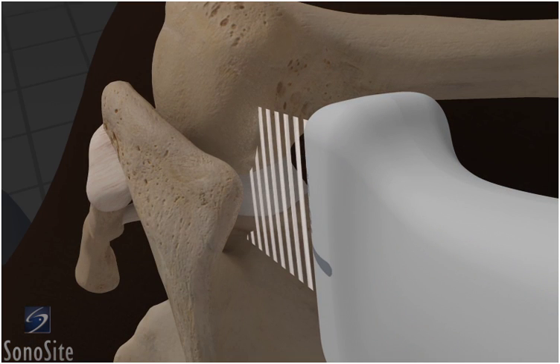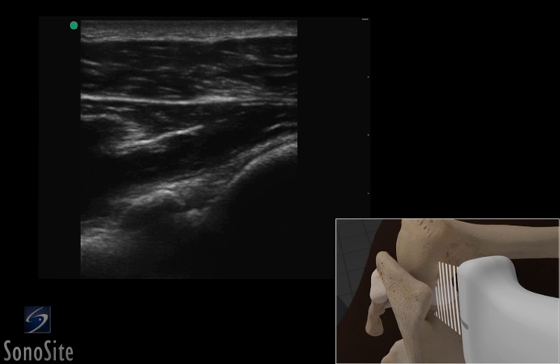The examination begins by locating the glenohumeral joint space, which lies below the deep fibers of the infraspinatus muscle, and the glenoid labrum, which appears as a bright hyperechoic region in the mid-portion of the image. The humeral head can be seen on the right of the screen as a rounded, bright hyperechoic image.